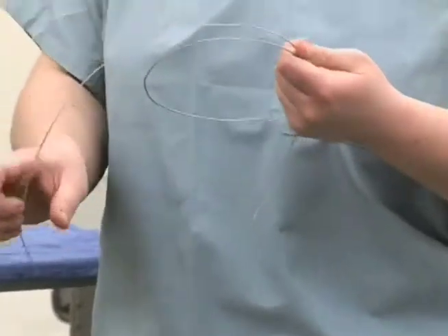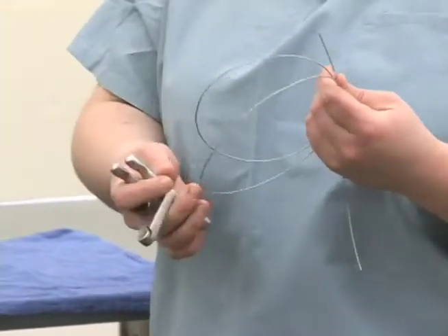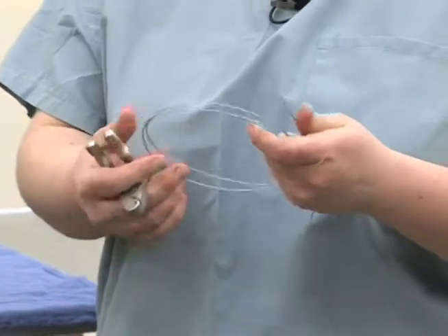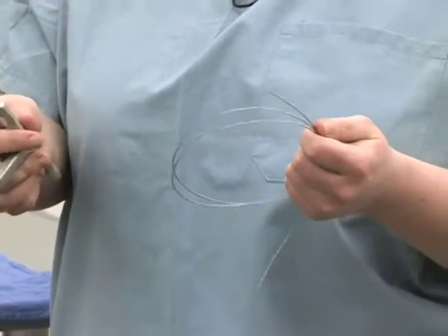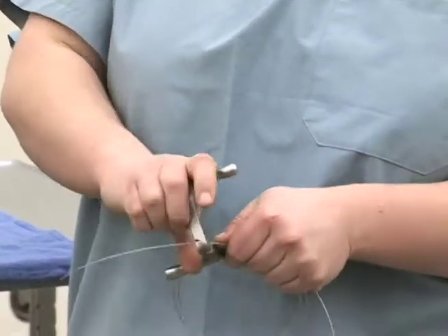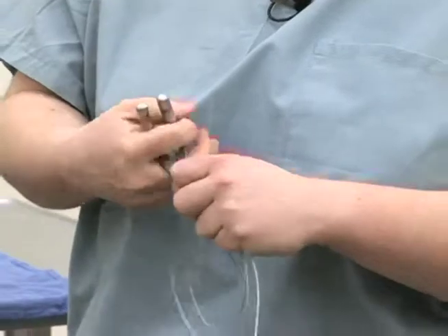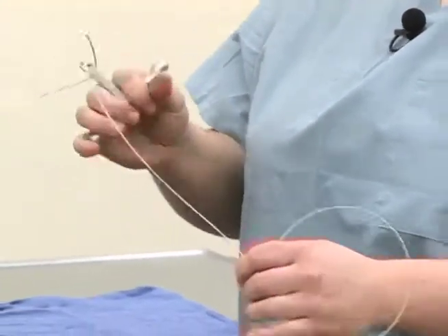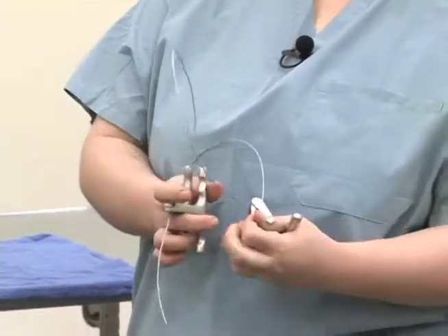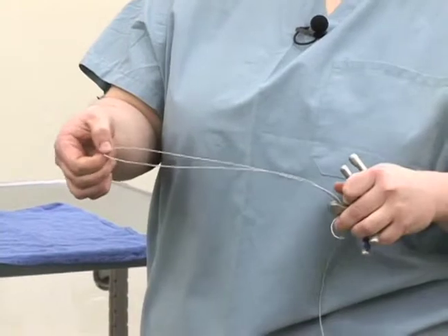The equipment that we typically use to perform this in the standing animal that is not sedated — and what is very easily done at home by owners — is the method that uses giggly wire or obstetrical wire that can be readily purchased at most farm supply type businesses. Then the handles that go along with them open up and allow you to clasp this abrasive wire and provide a safe surface for handling the wire when you're actually trying to put pressure on the tooth to remove it. You'll have one handle in one hand, the other handle in the other, and the surface in between goes back behind the tooth and provides the cutting surface on the inside of this loop.